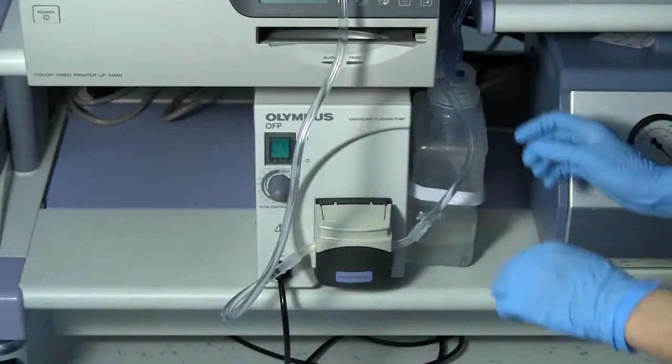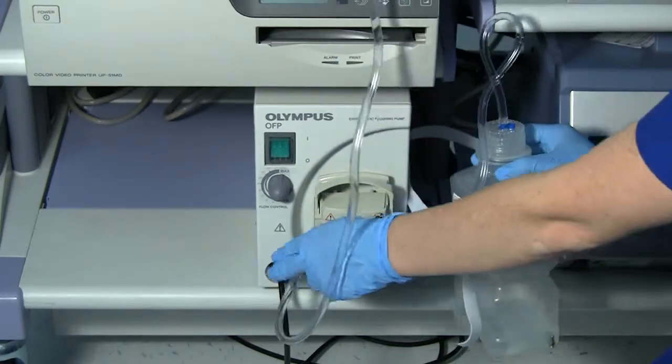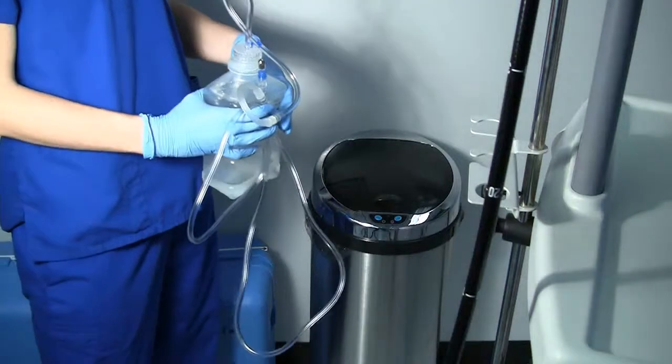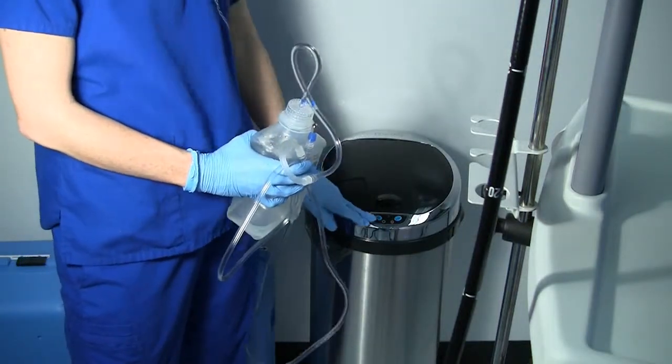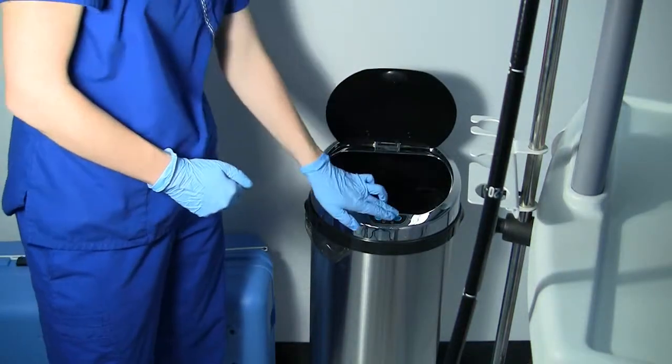After you are finished with all of the procedures for the day, unhook the water bottle from the Velcro strap and open the pump head, removing the tubing. Make sure it is disconnected from any scope, take the entire system, and discard it appropriately. Keep in mind.